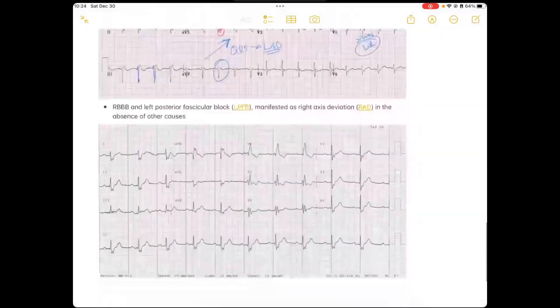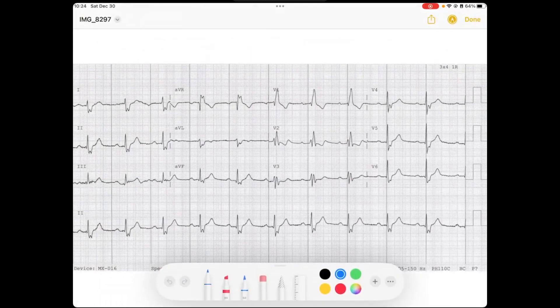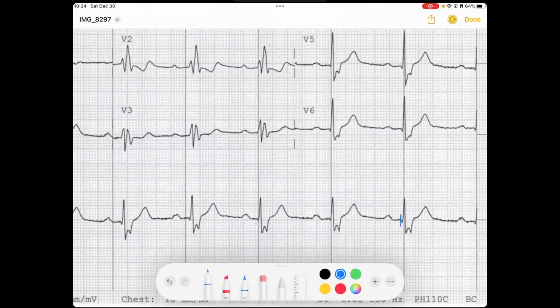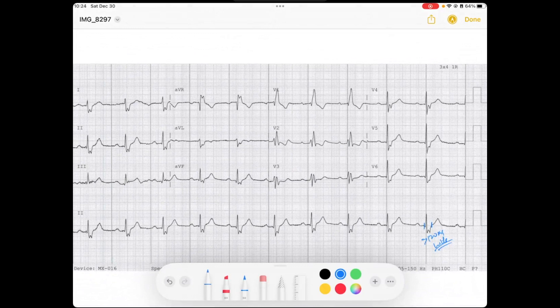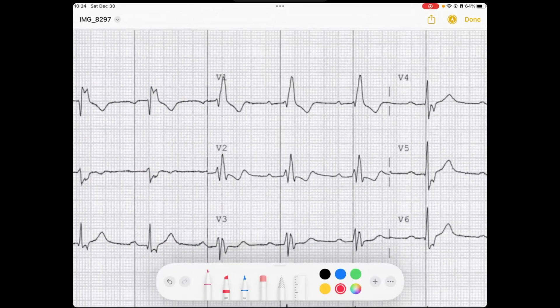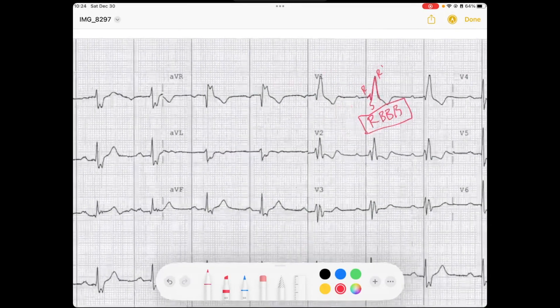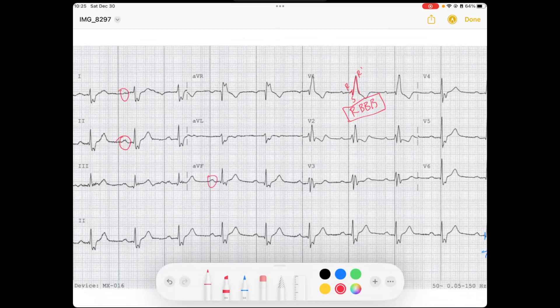Let's check out what this looks like on an EKG. We're evaluating the QRS and it's widened — greater than 120 milliseconds — making me think there's a bundle branch block. Looking at V1, I can see the RSR prime morphology, which in the setting of a wide QRS is diagnostic for a right bundle branch block. This is sinus rhythm — nice upright P waves in leads 1 and AVF. Incidentally, this patient also has a first degree AV block.